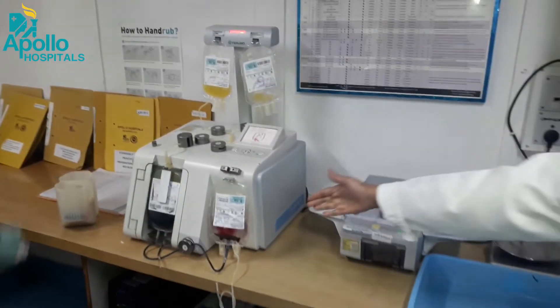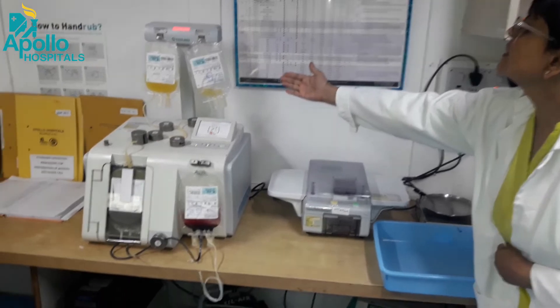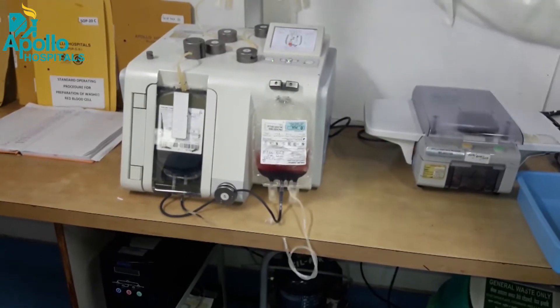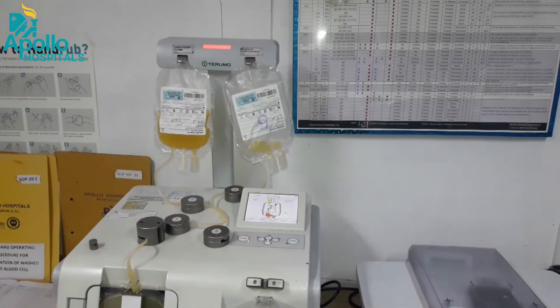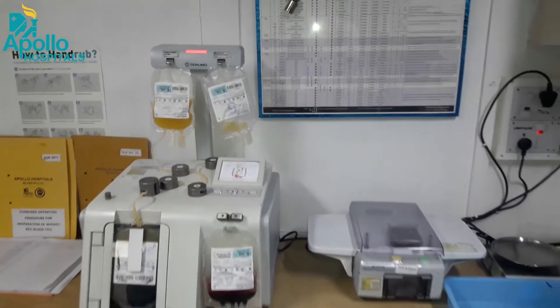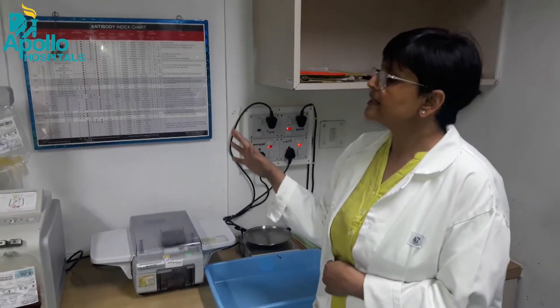This is the packed cell getting filled up in this bag. This is basically the plasma bag, and this is the platelet. The whole process takes about 3 to 5 minutes to complete. It is totally a sterile process in which all close connections are maintained as per the WHO standards.